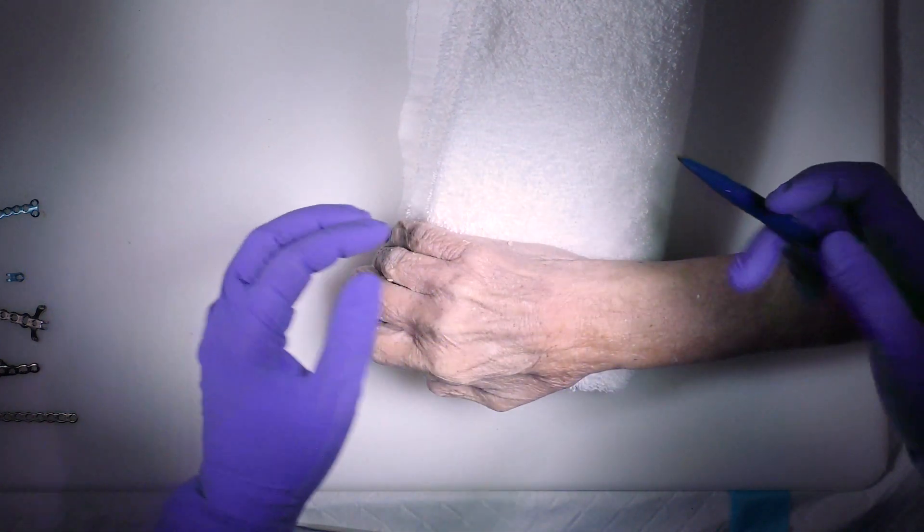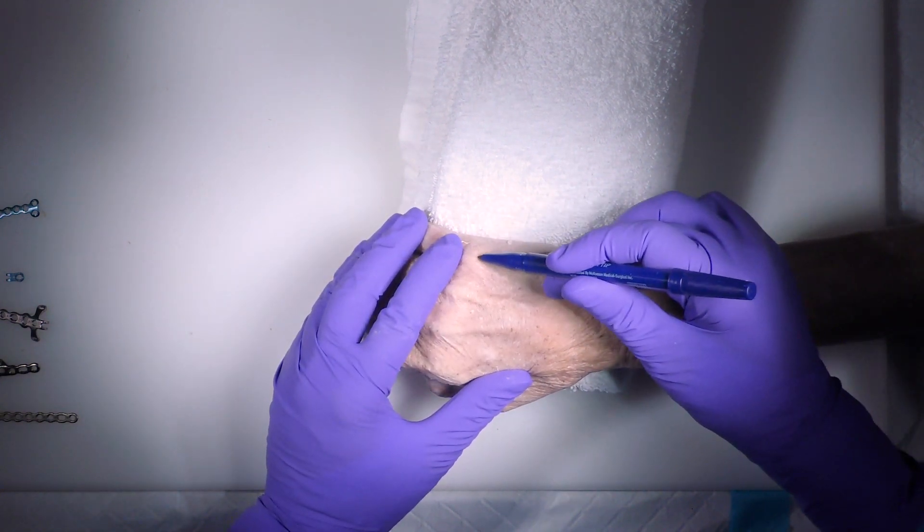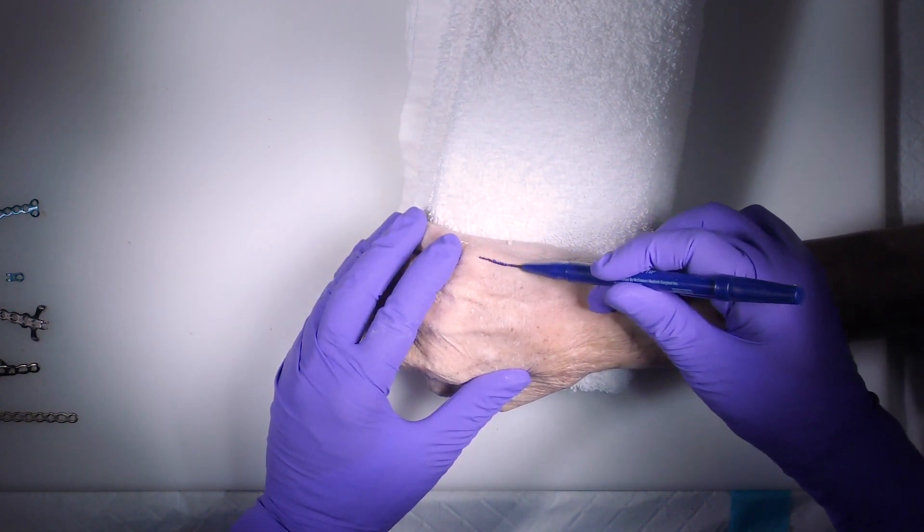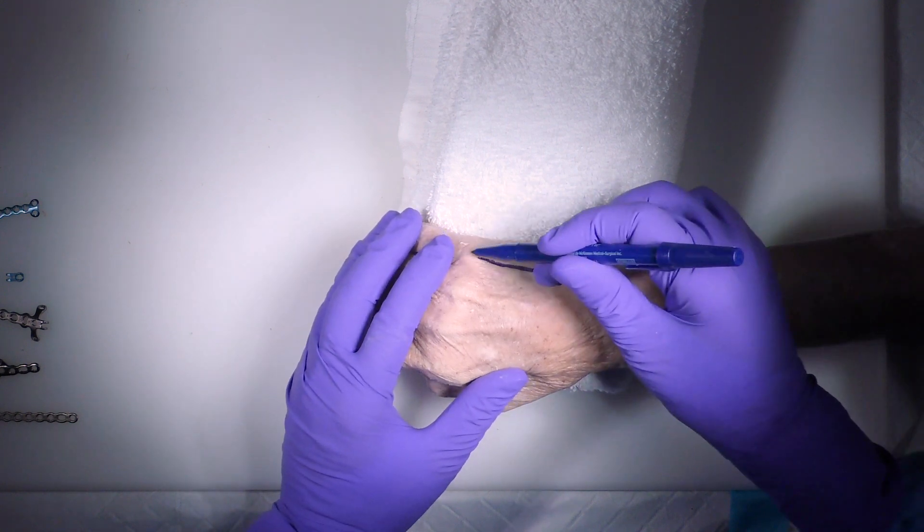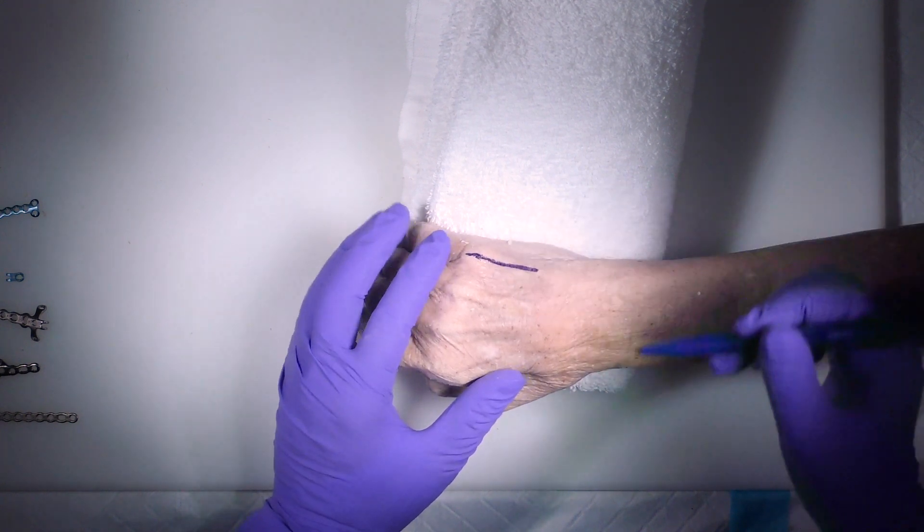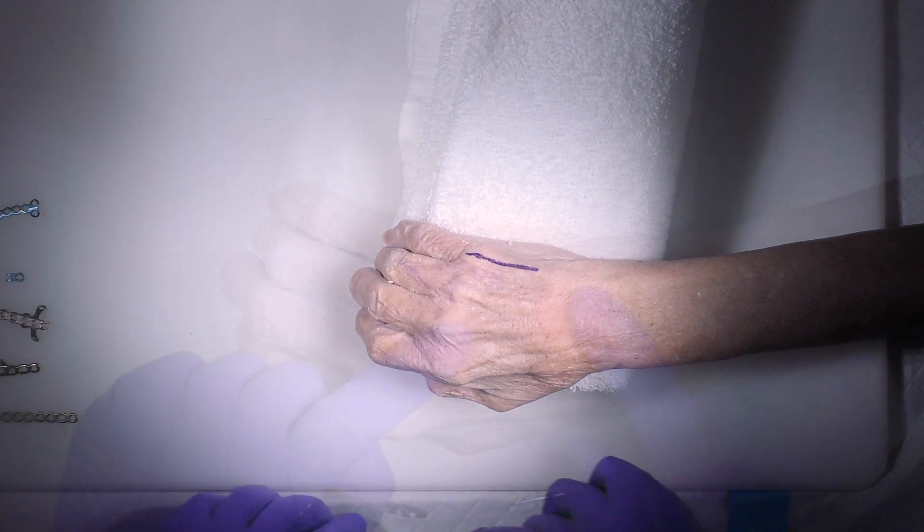But again, whenever you're exposing it at the back of the metacarpals, you're always navigating the extension. So I'm going to just do a simple line. We're going to get started here.